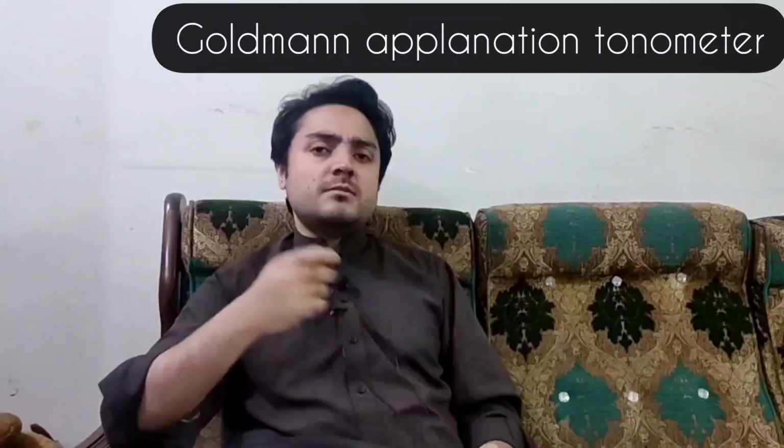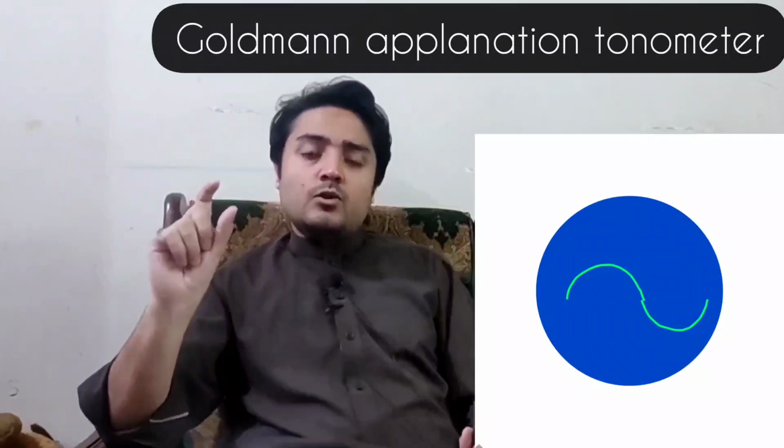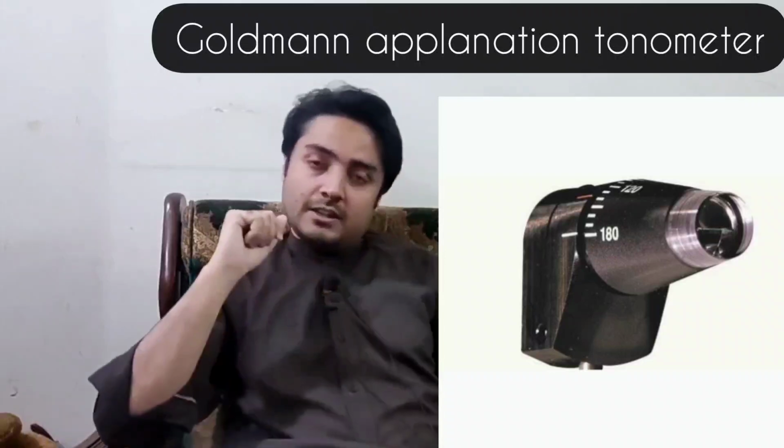You usually see these images, as you can see here, that there are two mires. You need to approximate them. So what are these two mires? In the Goldmann applanation tonometer, the probe or the biprism, that is the part that you usually touch to the cornea, has these mires in it.